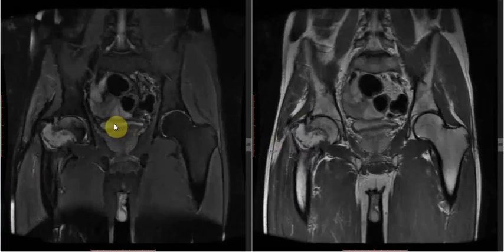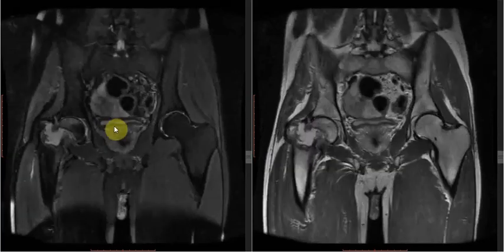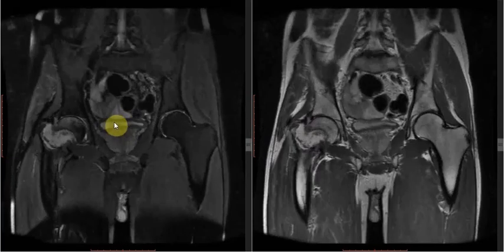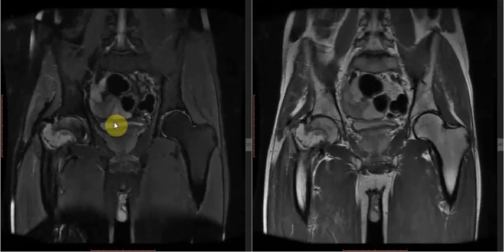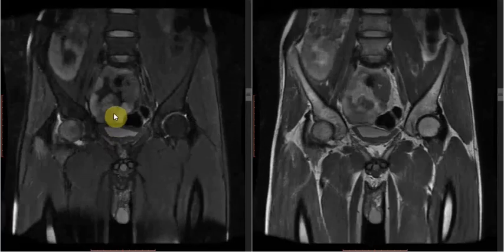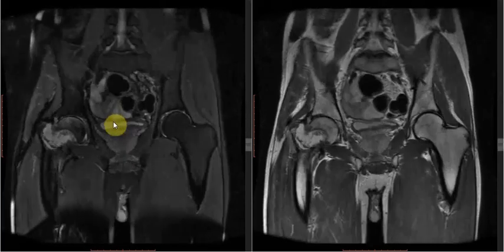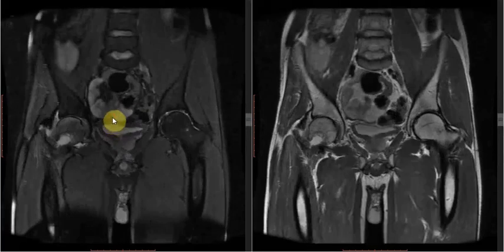There is presence of a well-defined osteolytic lesion in the neck of the right femur. As the patient is a young male, the probability of metastasis is quite less likely.